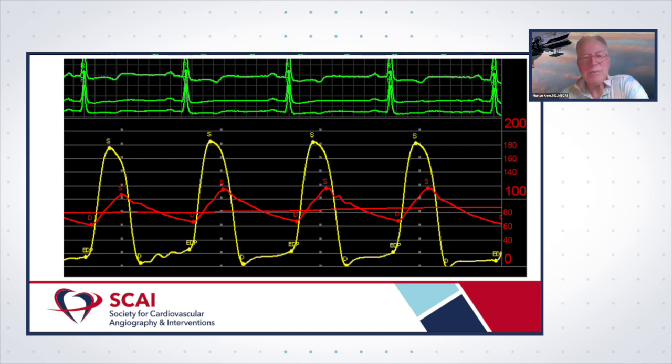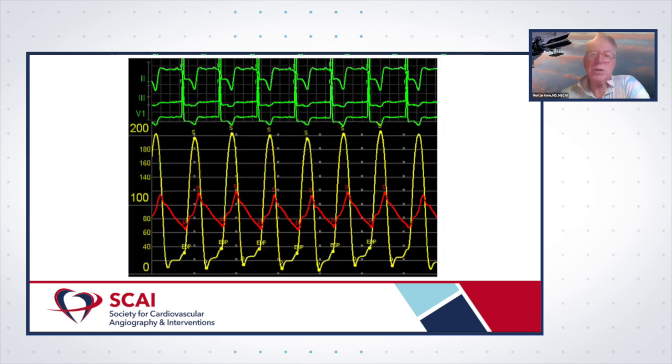Now, sometimes, here's another tracing we took from a patient who had an aortic valve in place. There was this initial rapid impulse upstroke and then a late gradient, which is kind of atypical for classic AS, but it shows that there can be some variance in the shape of the aortic waveform. This was thought to be related to the valve ring and not the valve itself.